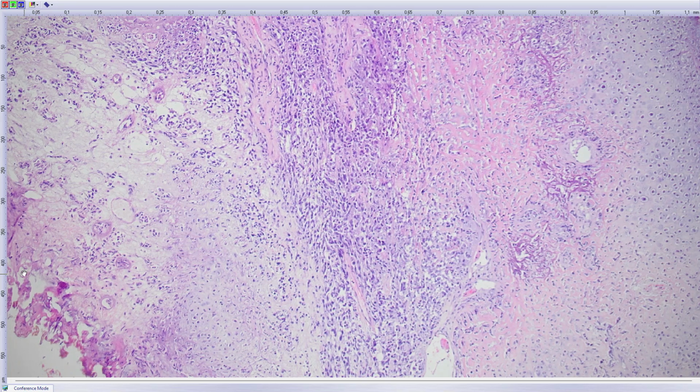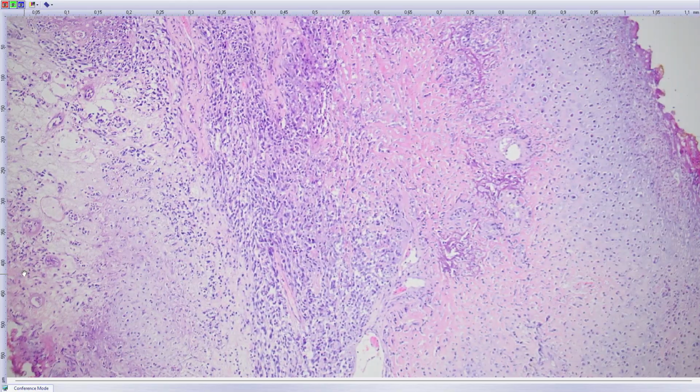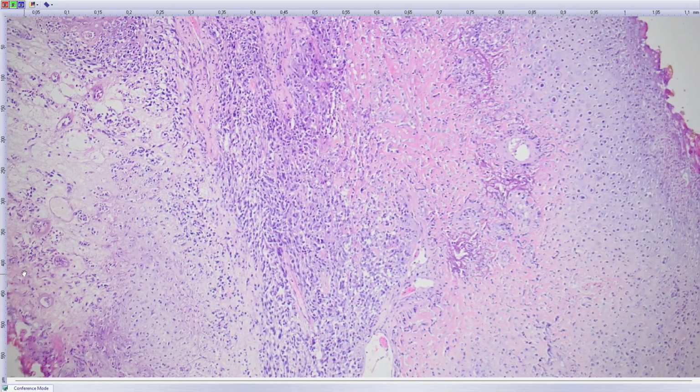in contrast, urothelial carcinoma may show sarcomatous differentiation and sometimes even heterologous differentiation in the form of osteosarcoma or some other kind of sarcoma.